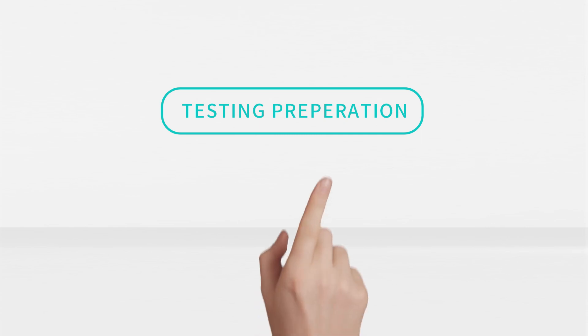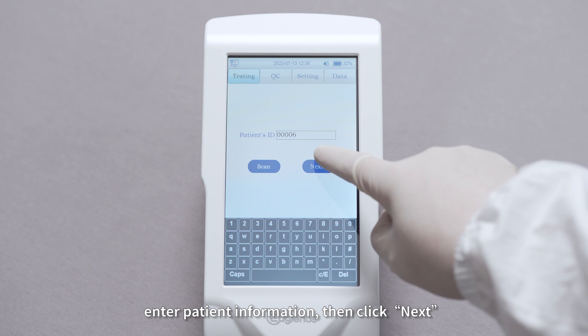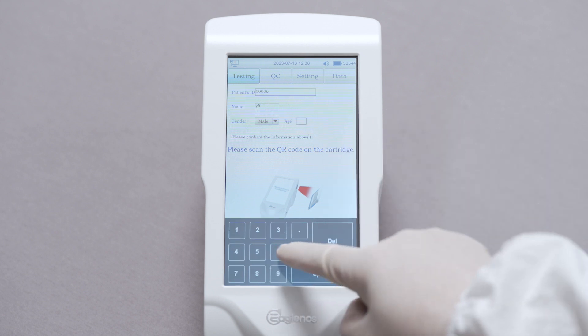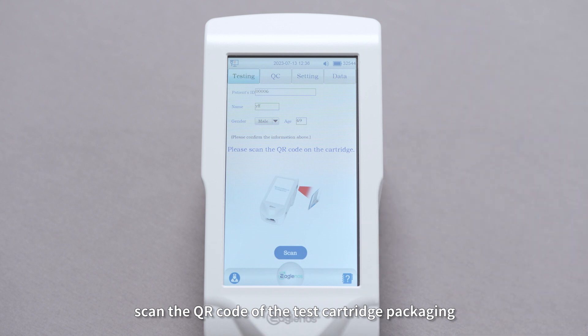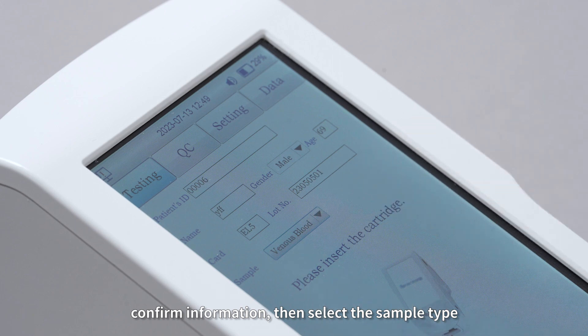Step 2: Testing Preparation. Enter patient information, then click Next. Scan the QR code of the test cartridge packaging. Confirm information, then select the sample type.